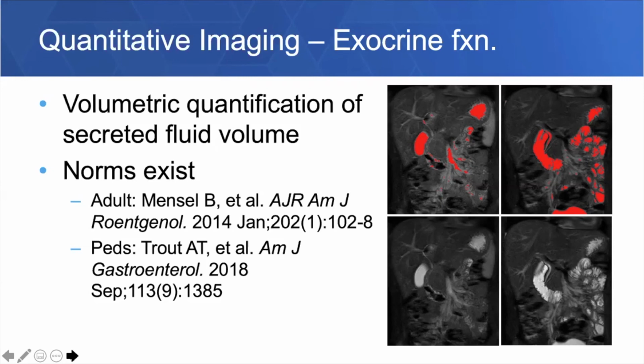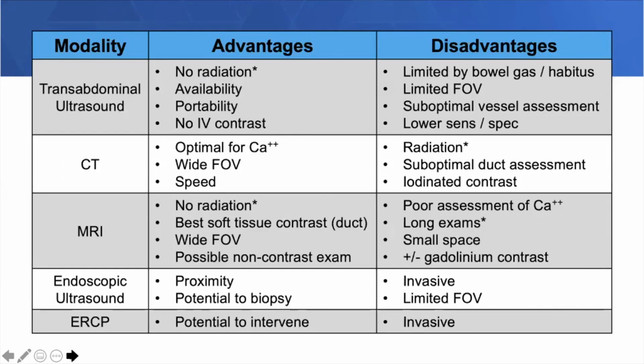So again, this is the most important table in the entire talk, okay? So in terms of your day-to-day use in clinical practice, this is the table I want you to leave here with. And again, it's in the files that you have in terms of helping to select one modality over another. And that's how you get a hold of me, okay?